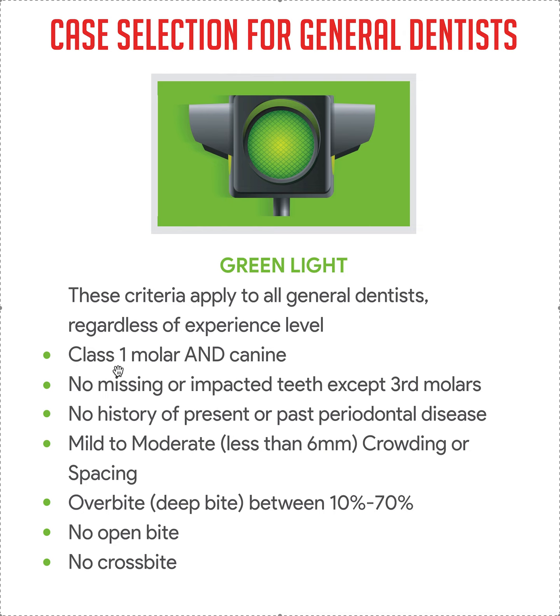And matter of fact, I'm not super thrilled if third molars are erupted. I'd actually rather they be out or impacted because it just complicates things. Really impacted, not partially impacted, in the bone, high and dry, not in the way. Class 1, so you can't even be 2 millimeters class 2. Solid class 1 molar and canine, all four bites on all sides, all 8.